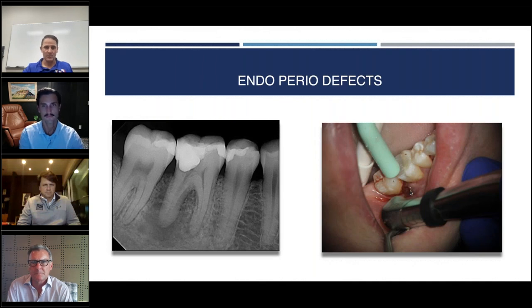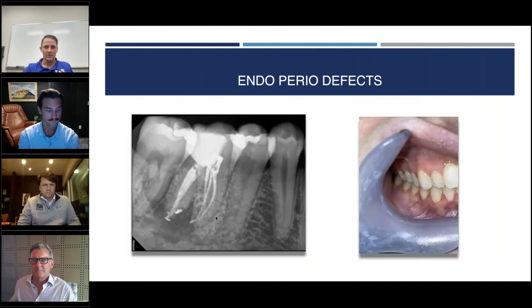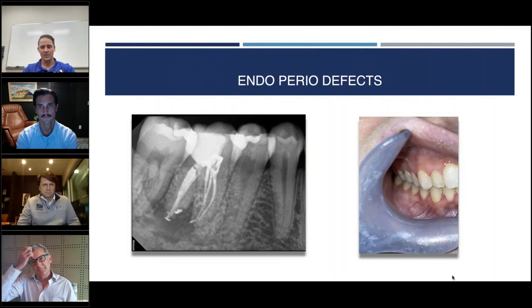So that's what we did with this case. And post-op, this is 1 week following treatment, so I had the patient back at 1 week. It's pretty simple. You just put it in there, step on the gas, and pull it out. Be aware if you're around the mental foramen or anything like that. But I do that on endoperio defects, sinus tracts, anything like that.